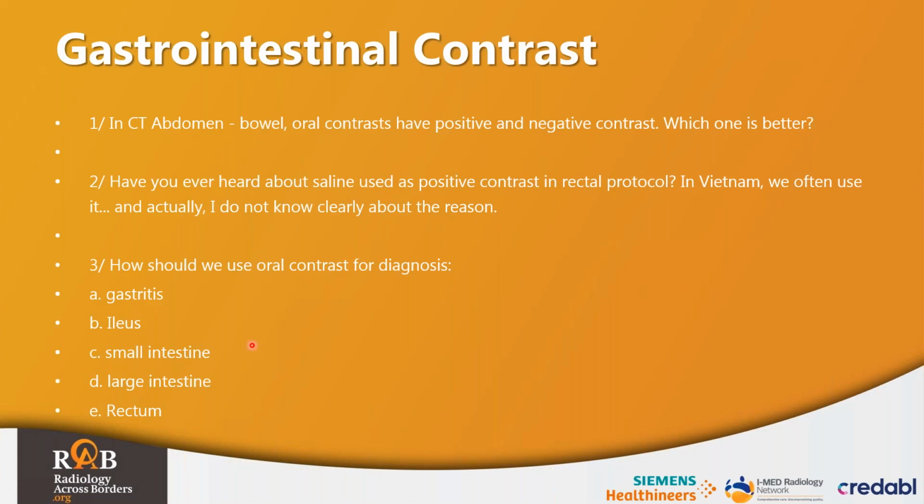So first of all, using oral contrast is becoming far less frequent in Australia. From my clinical experience and understanding, positive and negative contrasts have similar diagnosis rates. Therefore, the trend is towards the use of negative oral contrast because it's safer. And in saying that, it also often ends up being the reporting doctor's preference, as the clinical responsibility lies with them. That was in response to number one.